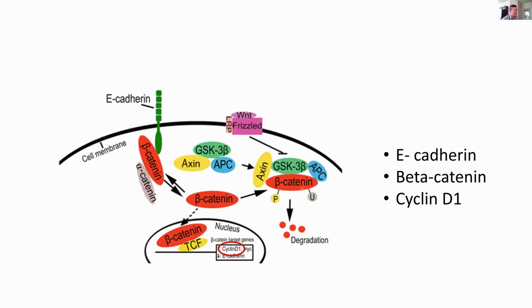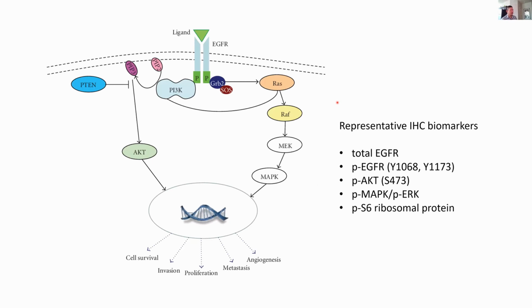It pretends that the entire world exists in a single cell. Doesn't talk about the different epithelial compartments or maturation. It doesn't talk about cell-cell interactions and whatnot. So I really wanted to get a sense of what was being expressed where. So went with some very standard IHC reagents.